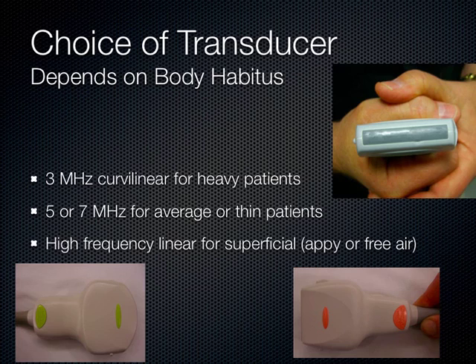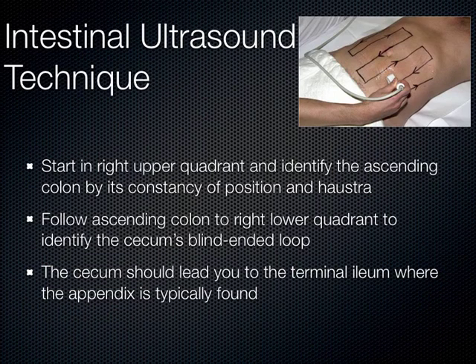For example, you're trying to find the psoas muscle, which is down by the spine, a deep structure. However, when you compress the skin 4, 5, 6 centimeters down into the body, you're so close to those structures that you can use this linear probe, which is why, for the most part, this is my transducer of choice. If I did have a very large patient like that guy we just saw, I'd lean towards one of my lower frequency curvilinear probes, hopefully one with a large footprint like the C60, but the linear transducer can usually get through a lot of this intestinal ultrasound.